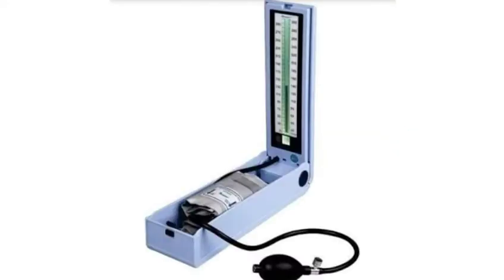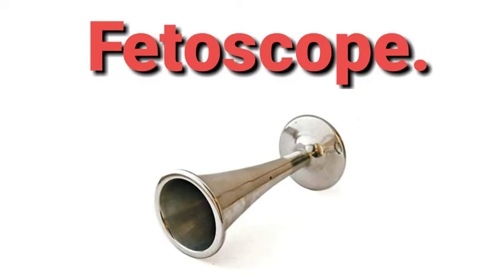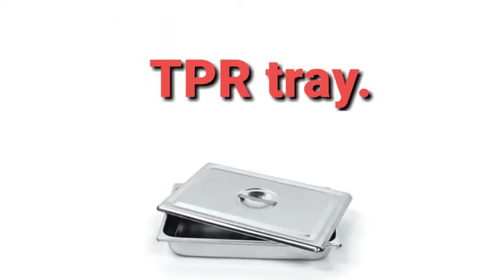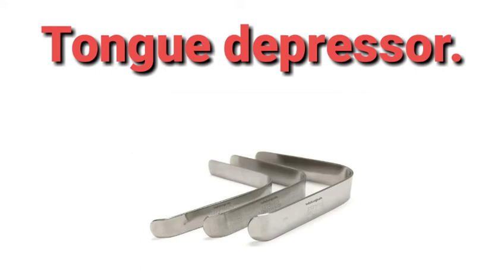First, the sphygmomanometer — its purpose is to measure blood pressure. Then the stethoscope, used to listen to body sounds created within the body. Then the fetoscope, used to listen to the heart sounds. Then the TPR tray, or temperature-pulse-respiration tray, used to assess the vital signs or cardinal signs. Then the tongue depressor, used to examine the mouth and throat.